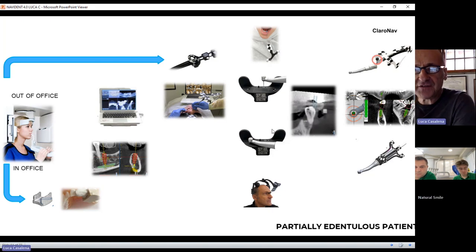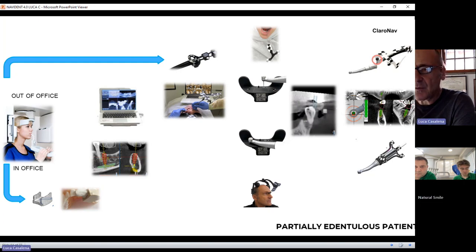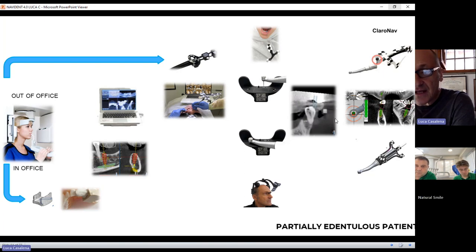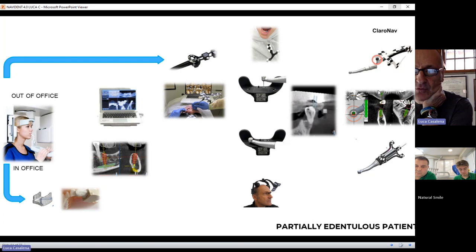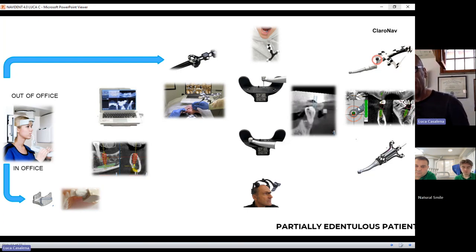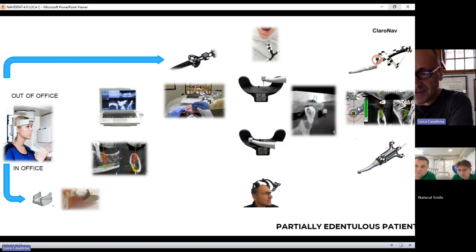Once you fix the optical target on the patient's jaw, and once you fix the optical target on your contreangle, you can move on to surgery. Then you carry out the accuracy check, and if everything is positive, you can move on to surgery. Surgery means seeing in real time what you do on the patient's anatomy.